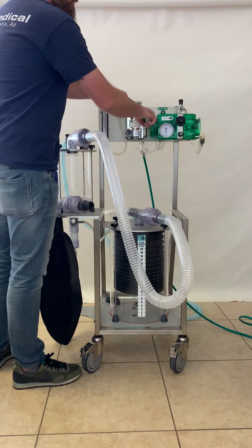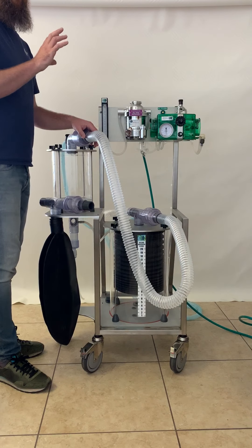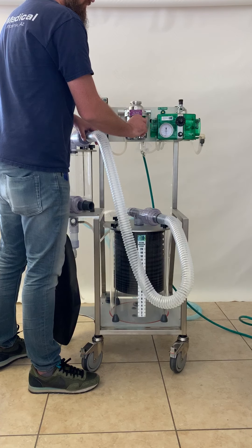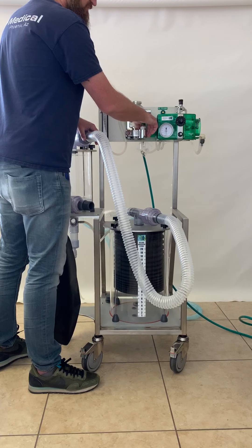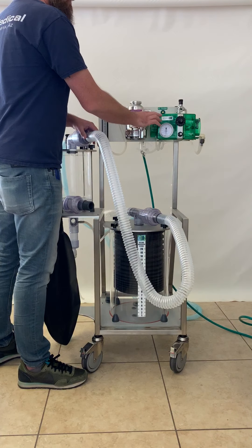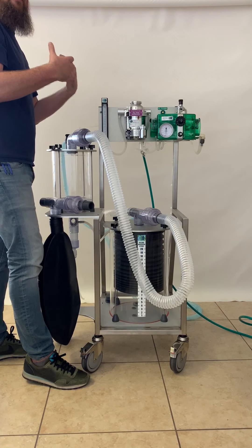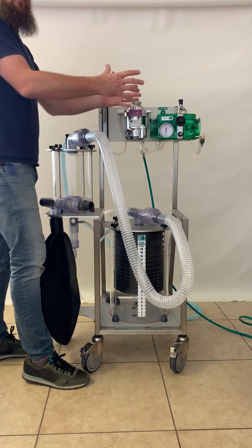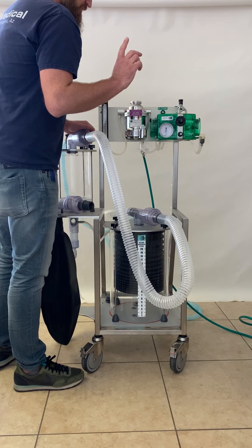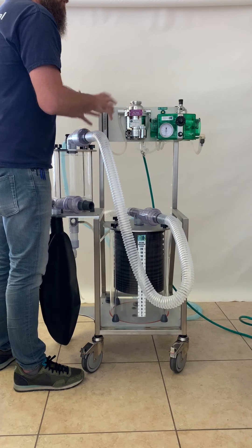Starting effort on the ventilator is the effort the patient has to exert if you want the patient to be able to trigger a breath. Generally we leave that at about 20. Increasing the starting effort makes it more difficult for them to trigger a breath; decreasing it makes it easier. So if you would like the ventilator to assist the patient that's already spontaneously breathing, you can let the patient trigger the breaths — if they give a little starting effort, the machine will then trigger and give them a full breath. That is explained in detail in the manual. That is the assist and control ventilation mode.